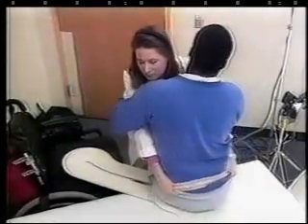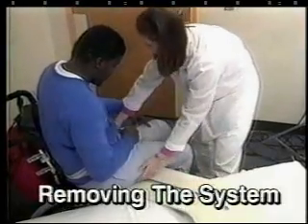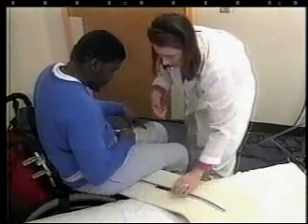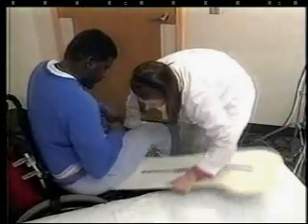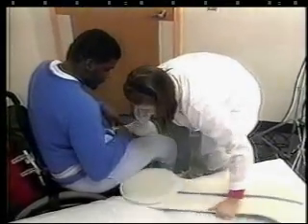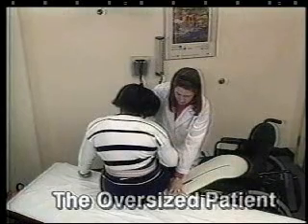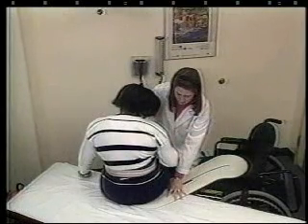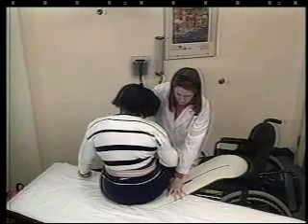To say it again, remove the system from under the patient. A good rule of thumb is simply to be as gentle as possible. A good technique is to gently rotate the seat. One thing we do know is that being toward the back or trailing edge of the seat distributes the weight in a way which contributes to a smoother, easier transfer. That makes the Beasy particularly helpful for transferring oversized patients.